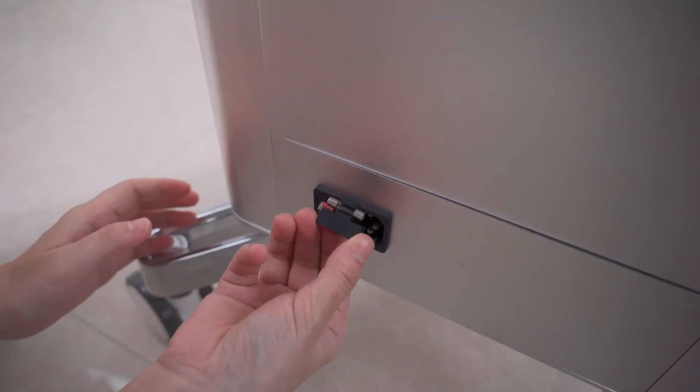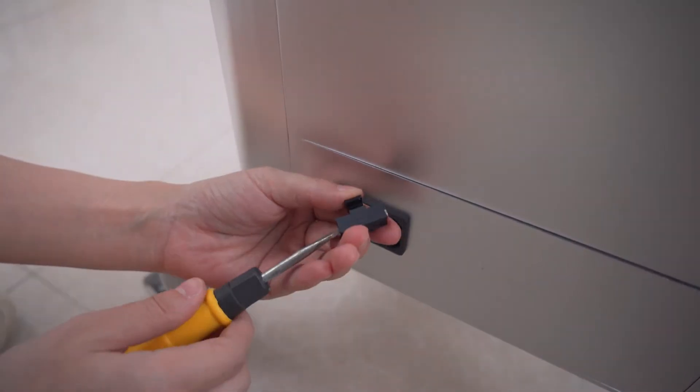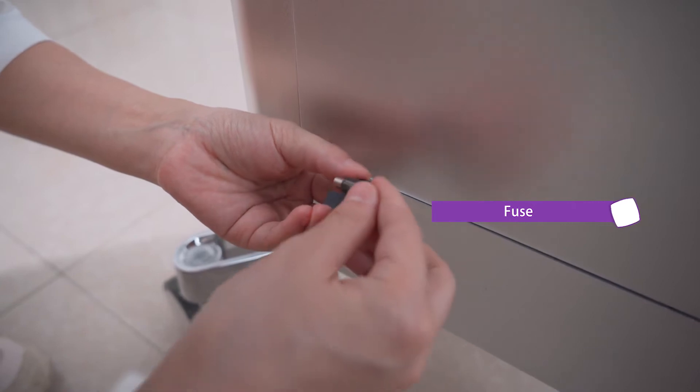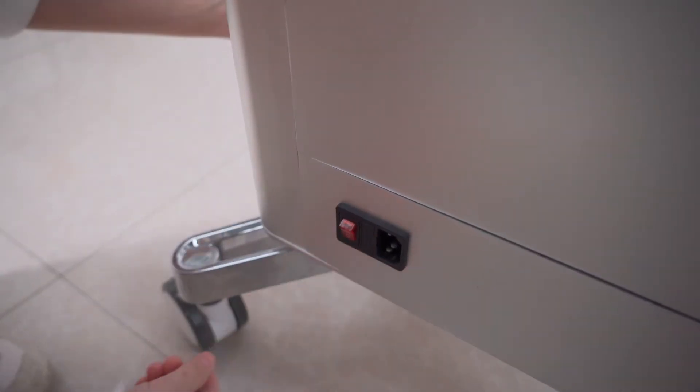There are two spare fuses in the accessory bag to replace broken ones in the device if any. Use a screwdriver to pry open the position of the fuse. When the fuse in the device is broken, replace it with the spare fuse.